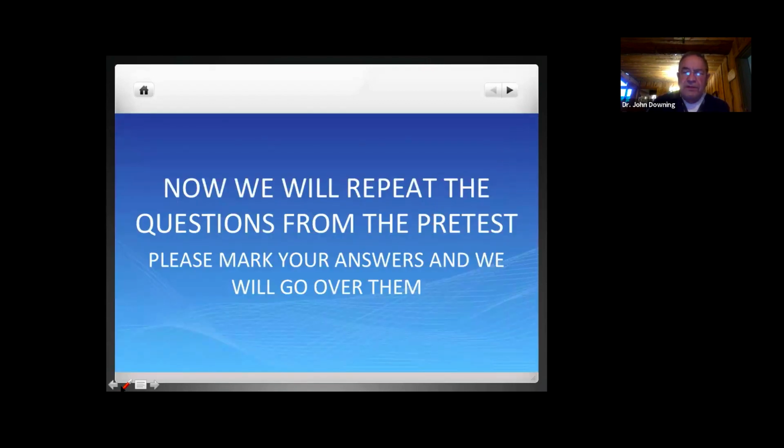Now, we'll repeat the questions from the pretest. Please mark your answers, and then we'll go over the correct answers. Okay, Lawrence, let's go back to question 1. Show us the choices and see which is right. Okay. Why do we need to do hydrodissection with phaco cataract surgery? You want to free up the lens to rotate it from the peripheral adhesions between the cortex and the capsule. And practically everybody got that. Good deal. Very nice.